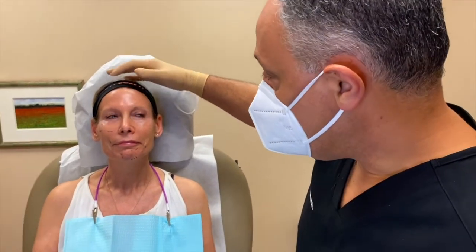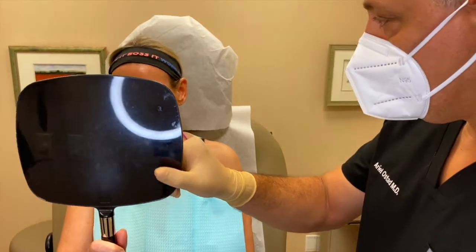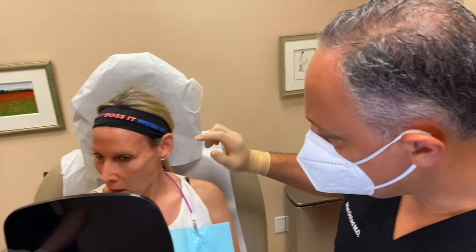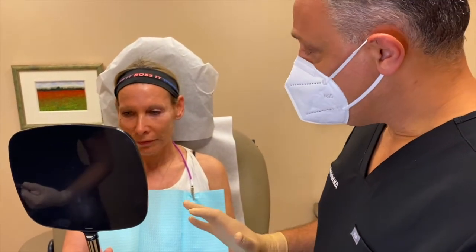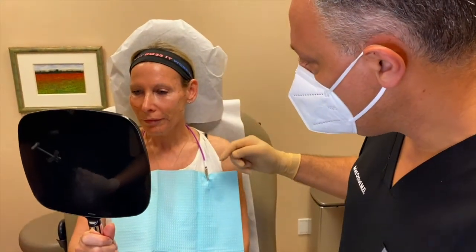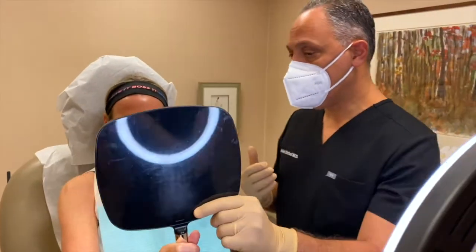So can I show this to you? Because I want you to be involved with this too, so you get excited. This was just really one syringe. Look at your temple. Mm-hmm. If you notice, compared to the other side, it's not as hollow. You are going to see some needle marks, but we're going to just stop there. I would probably inject another syringe of that same filler maybe in a month from now. But what I wanted to point out is, do you see the improvement in your jawline? Yes. Do you see how this jawline is a little bit higher compared to here? Mm-hmm. Okay, so that to me, I get really excited.